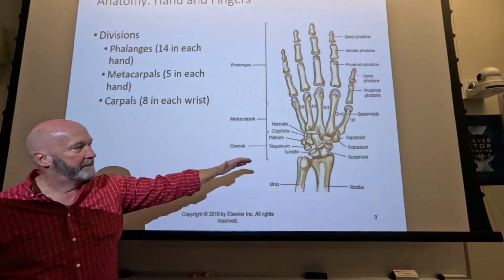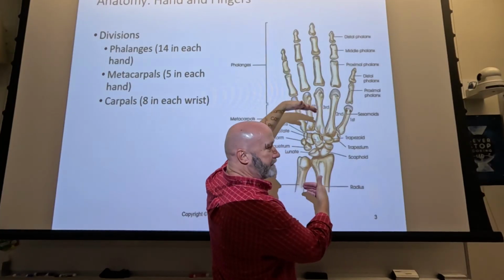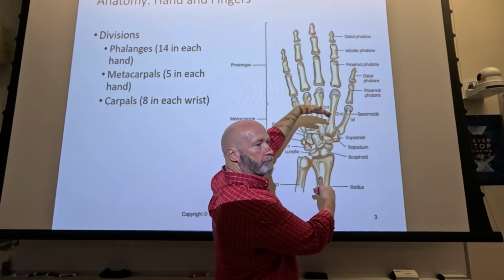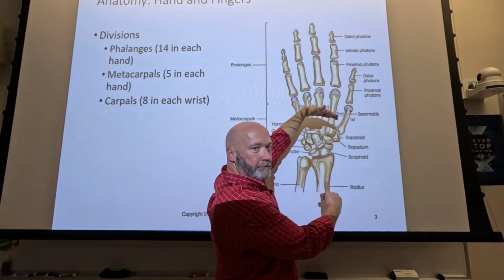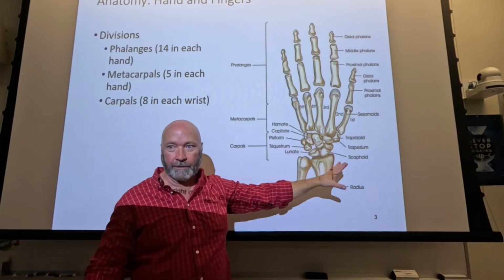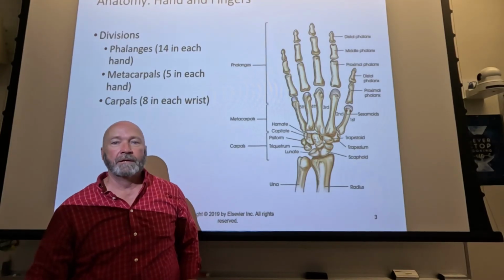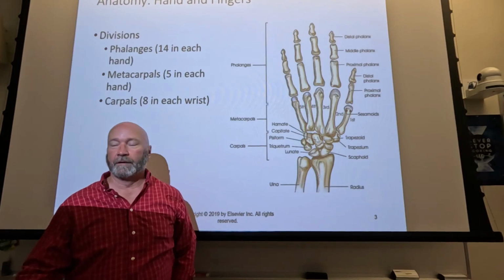So let's say that what we want to see is our wrist bones. All right, so we're going to do a different exam for hand and wrist. So where are we going to center for the wrist bones? To the carpal bones, right? So we're doing a forearm. So it's in the middle of the wrist bones. We're doing a forearm. What specific is in the middle of the forearm that you could center to? Nothing, right? It's just the middle of the forearm.